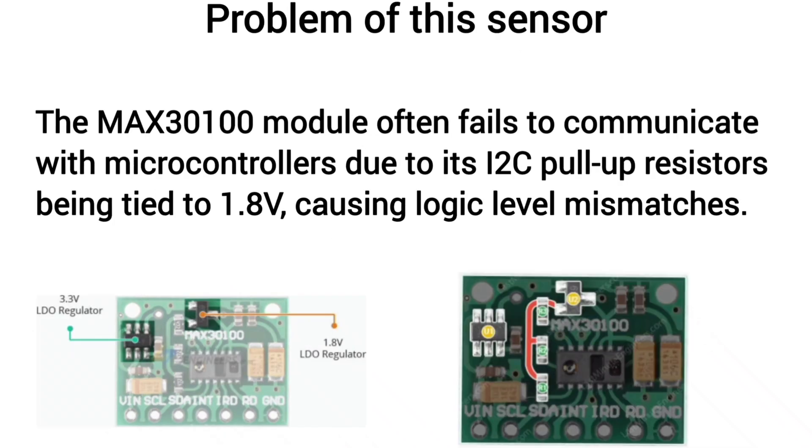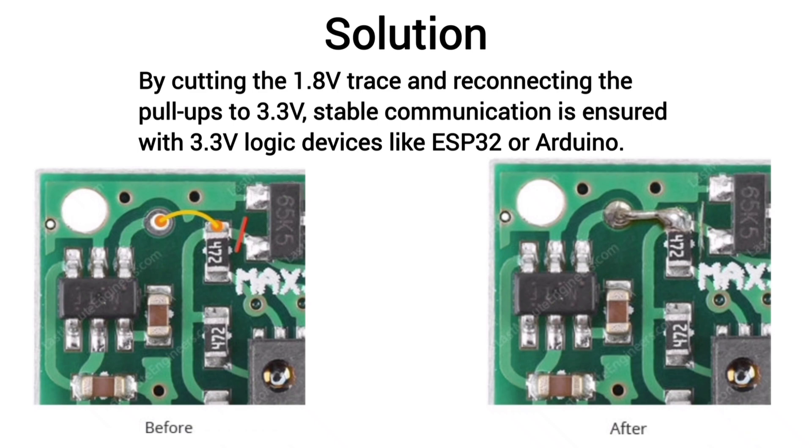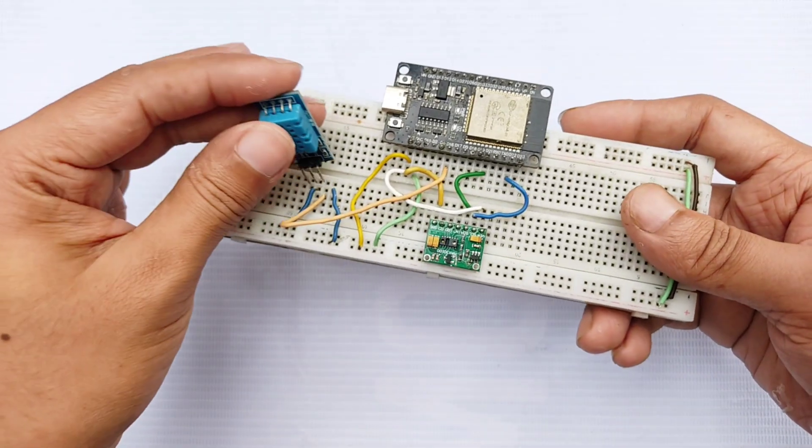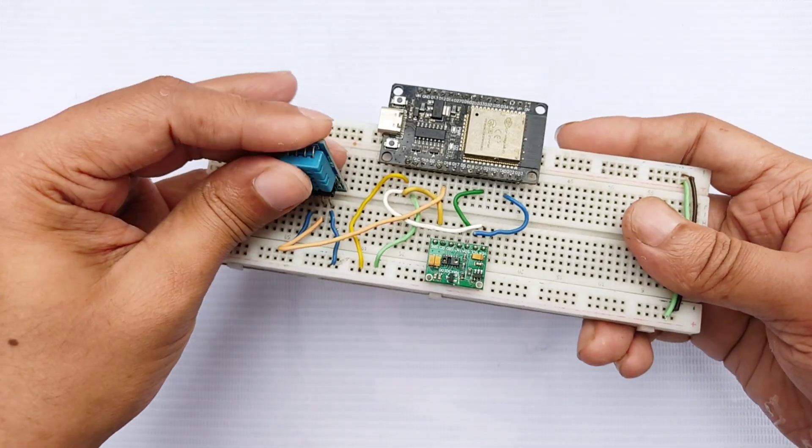However, a common issue with this module is that its I2C pull-up resistors are tied to 1.8 volts, which causes communication problems with 3.3 volt devices like the ESP32. To fix it, simply cut the 1.8 volt trace and reconnect the pull-ups to 3.3 volts for stable operation.